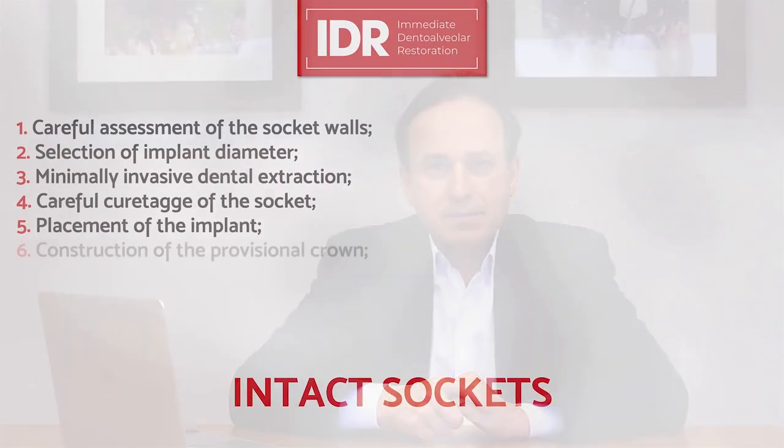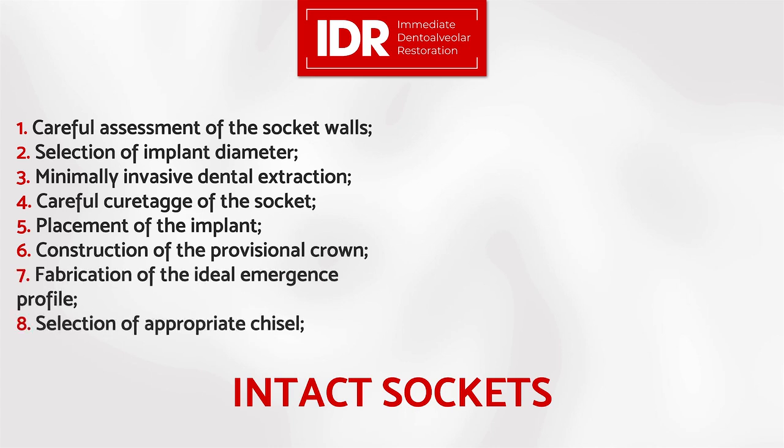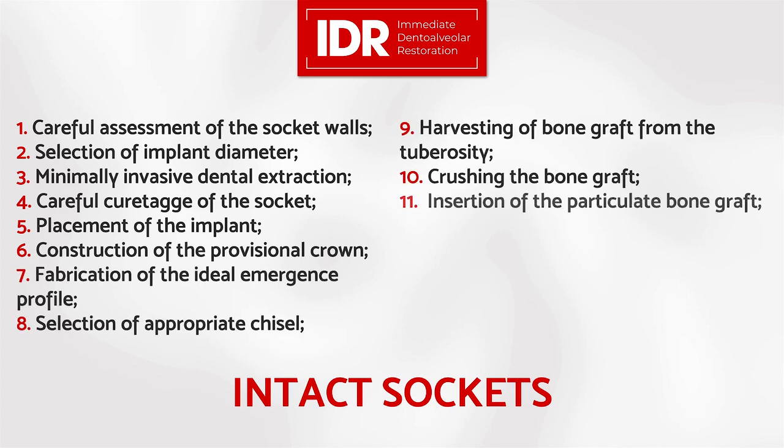First of all, the use of corticocancellous particulate bone as a bone filler for intact socket. I will present for you its protocol from the beginning to the end. The protocol is performed in 14 steps.